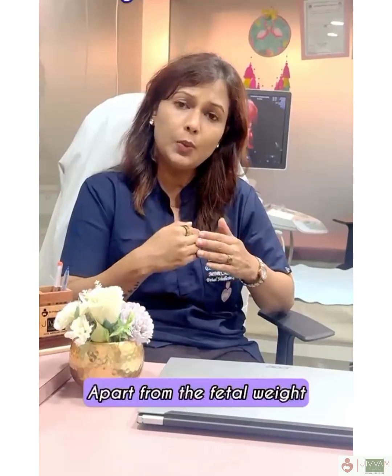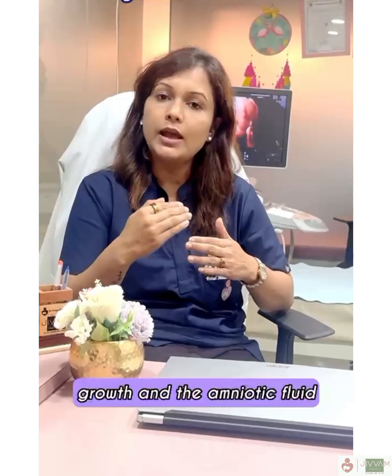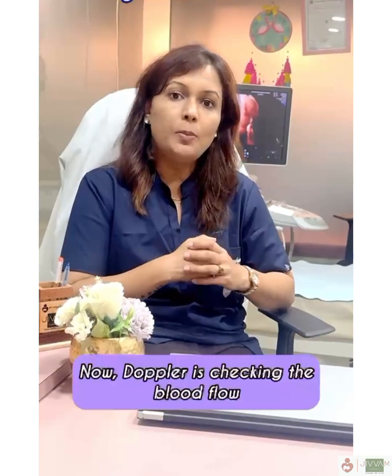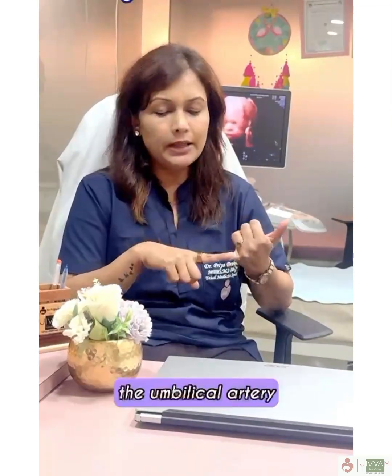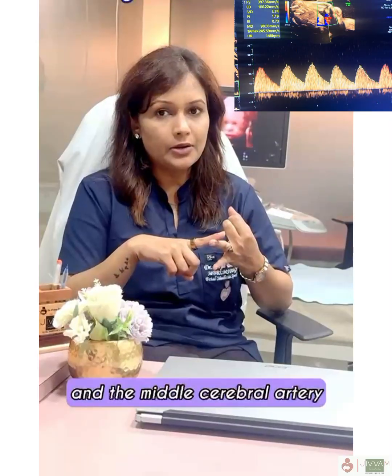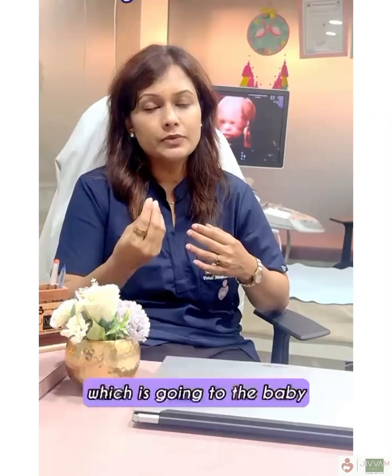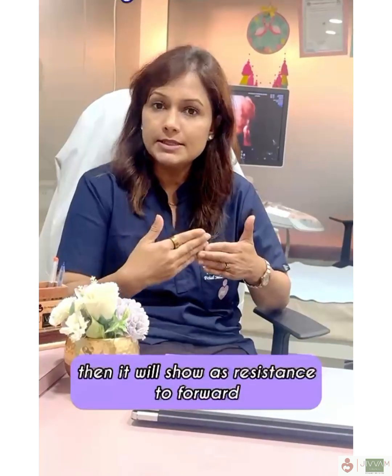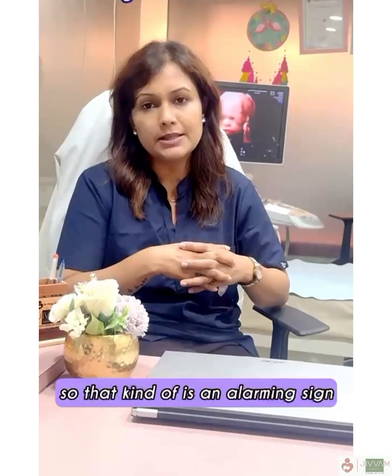Apart from the fetal weight, we also check the growth and the amniotic fluid. We also check the Dopplers. Now, Doppler is checking the blood flow which is going to the fetus. It is checked in the arteries, the umbilical artery and the middle cerebral artery. These arteries will give us an assessment of the nutrition which is going to the baby. If it is not going enough, then it will show us resistance to forward flow in these Dopplers. So that is an alarming sign.